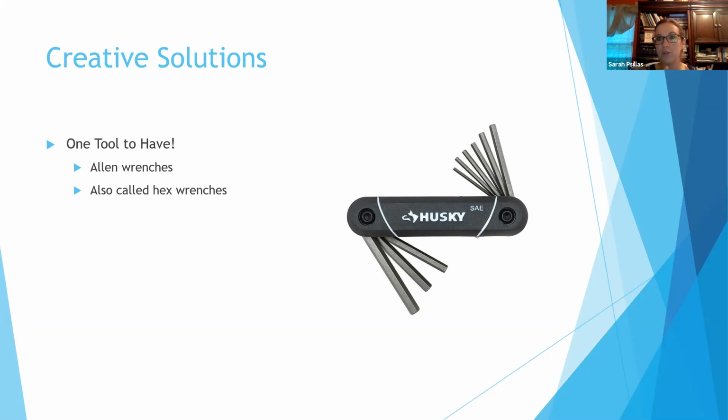It was a skilled nursing facility, but I did mostly wheelchairs. I kept one of these in my pocket at all times. Some people call these Allen wrenches, some people call them hex wrenches. If you have the availability to them, it's really your one tool, because any wheelchair that's donated or custom is pretty much adjusted with this one tool.